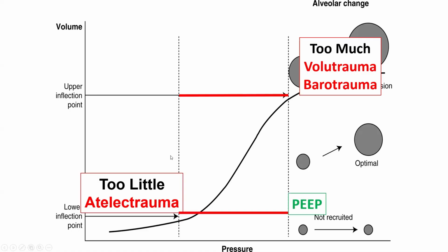But we're good at that. We fix them with PEEP. We set PEEP up. And again, that's to prevent them from collapsing.